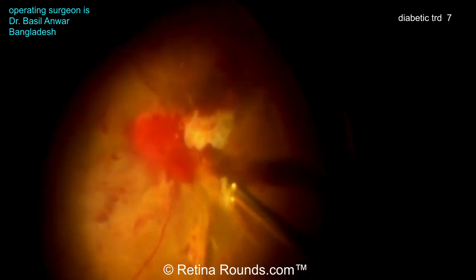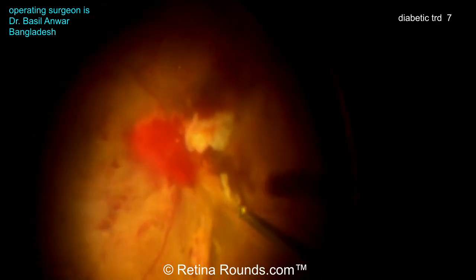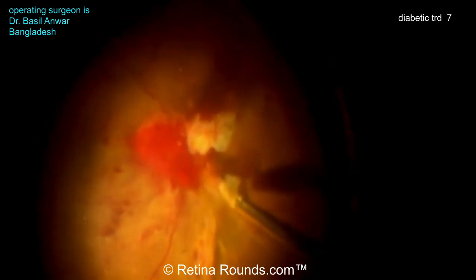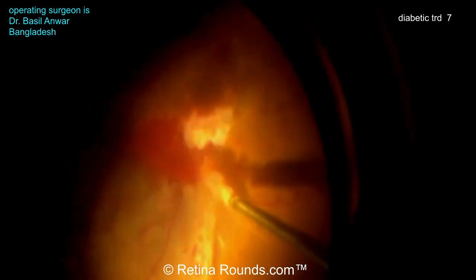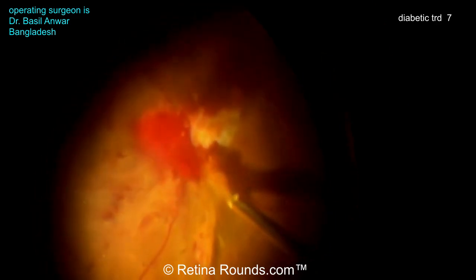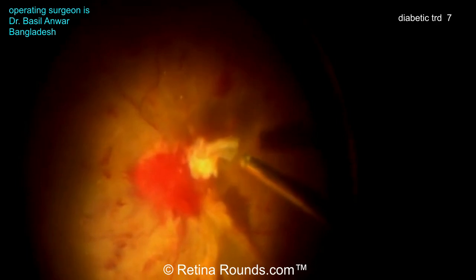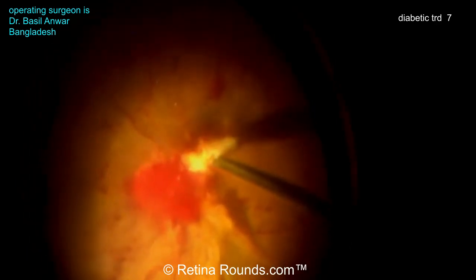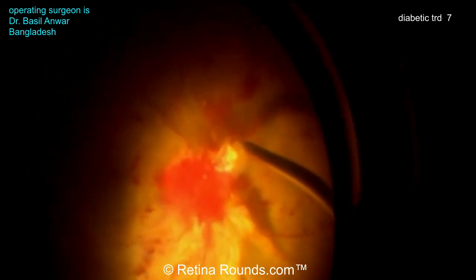Now it looks like he's going to try to delaminate this peg. You could certainly leave this alone — you can cauterize it if it's oozing and just leave it. But he's opting to go ahead and delaminate this, which is basically where the whole fibrovascular membrane is removed right at the trunk. This is a very nice example of this technique where the cutter is wedged right underneath the junction between the fibrovascular membrane and the retina so that the butt of the cutter is almost holding the underlying retina back.